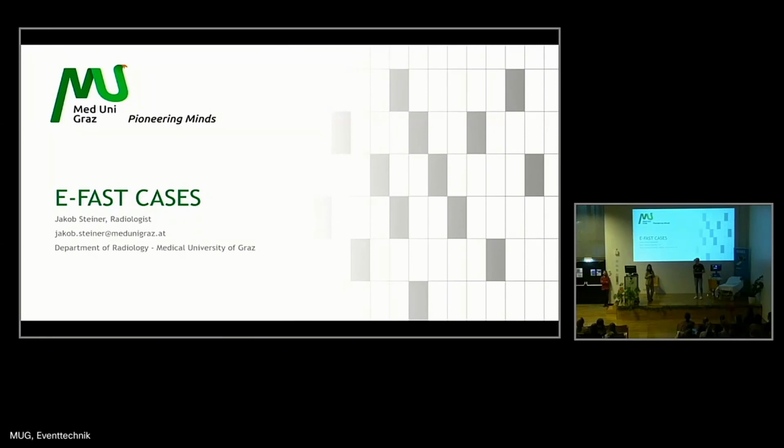So everybody is going to have eFAST. It is performed on a daily basis, day and night. Sometimes it is 1 time per day, sometimes 10 or more. It depends on the day.